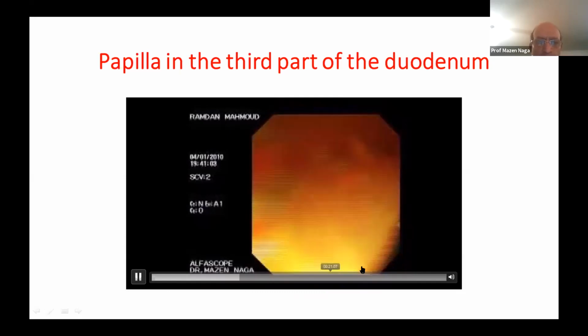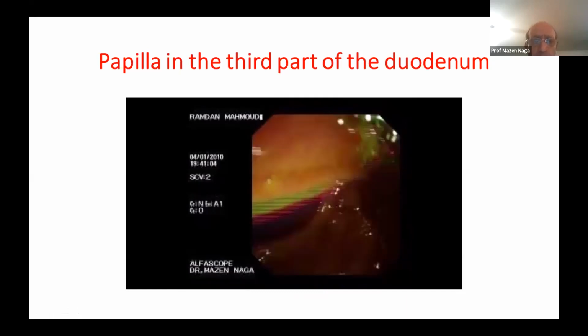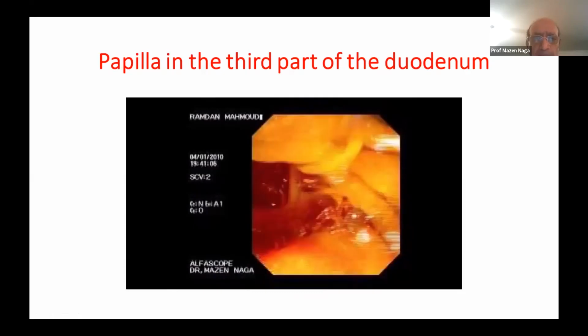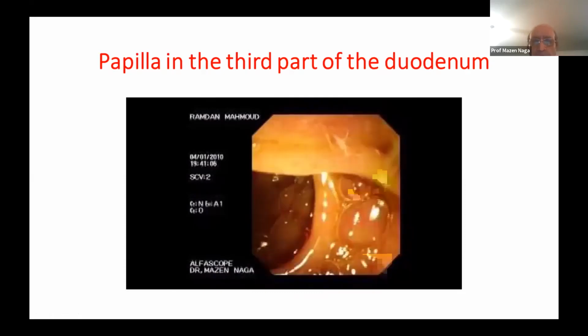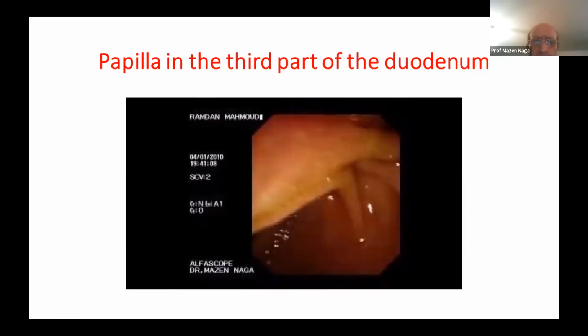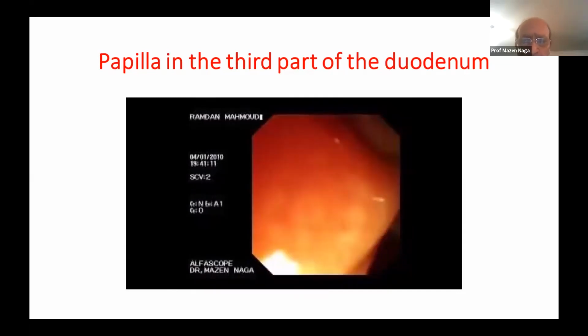It's not possible to make it faster. We must wait to see the position of the papilla and how we can cannulate. I didn't shorten the film, to show how difficult it is, if the papilla is in the third part, to locate, to find and to cannulate.